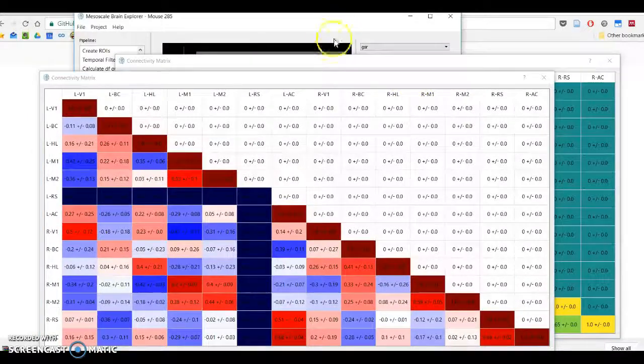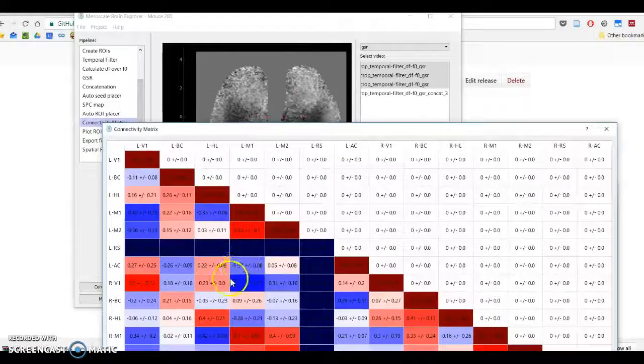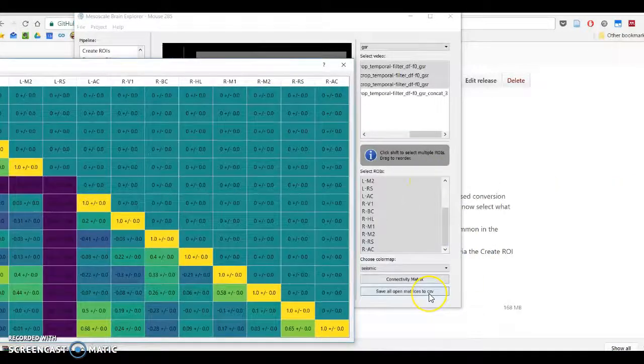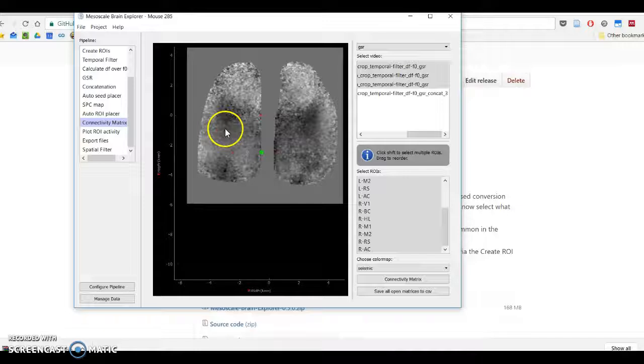So next, you might be asking, okay, so what is the standard deviation? What do these values actually mean? If I quit these, I shall quickly save this matrix to file. I'll show you that in a second. So what did those standard deviations mean?